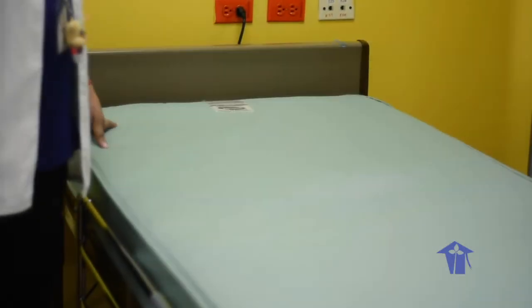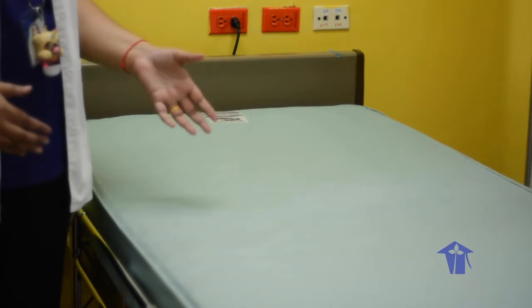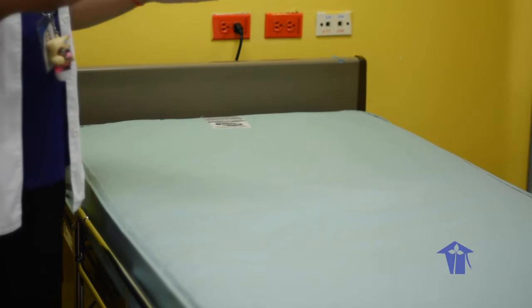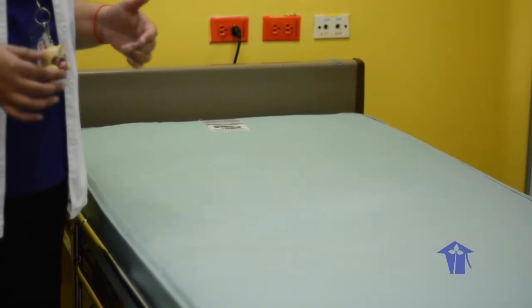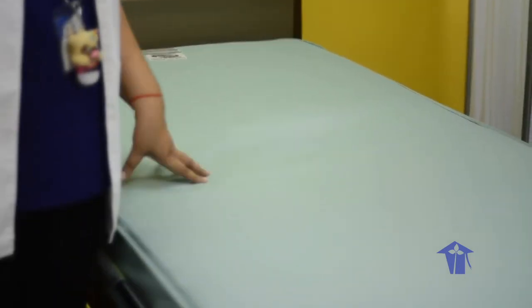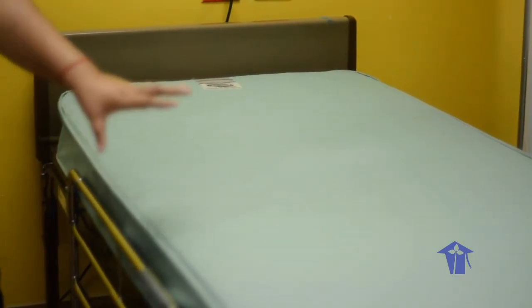What we are going to do now is an unoccupied bed. Again, unoccupied bed means nobody is in the bed. It is also known as an admission bed, meaning that the bed is currently empty and probably somebody is going to come in, alright? So this bed has nobody in it currently, but there was probably somebody in the bed. So you must always clean the bed first before you bring another patient in, alright? Cleaning the bed means not only the mattress, but the entire bed, alright? Because you don't know if bodily fluid had fallen anywhere else on the bed.